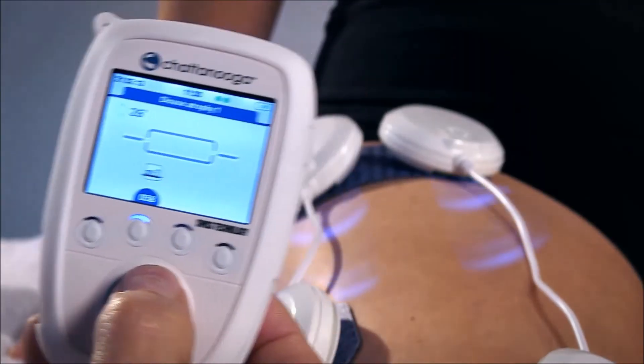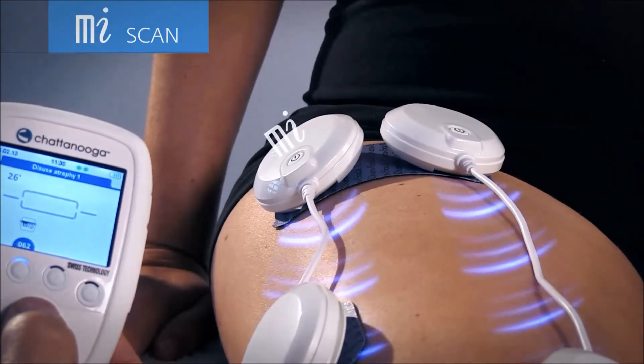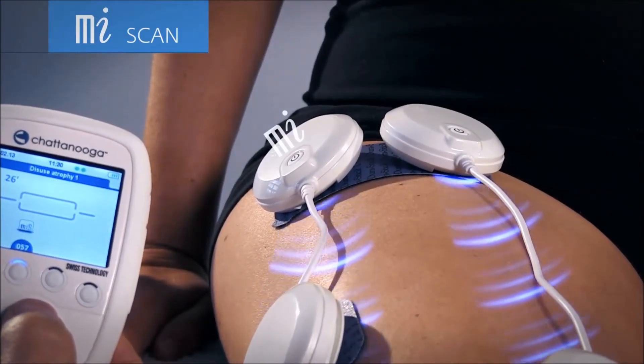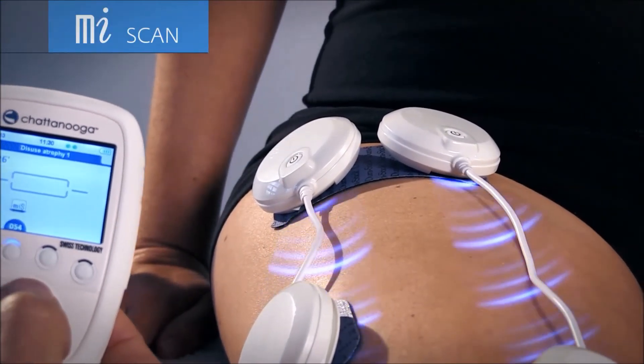MI Scan uses the sensor to determine and tailor the optimal stimulation parameters for each session.